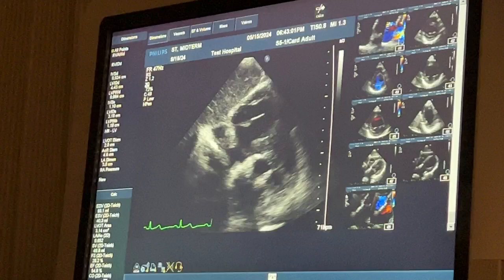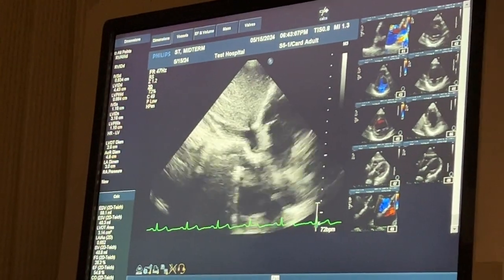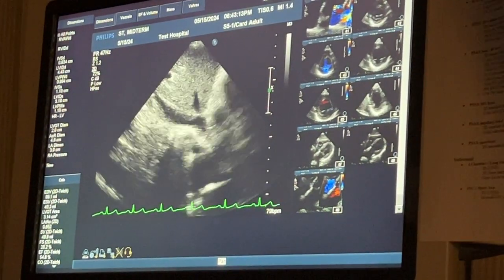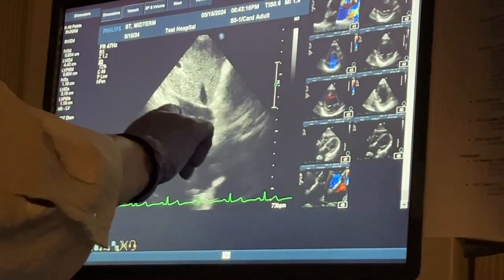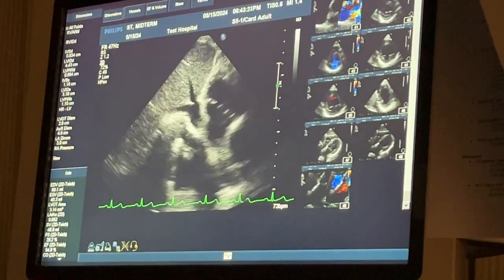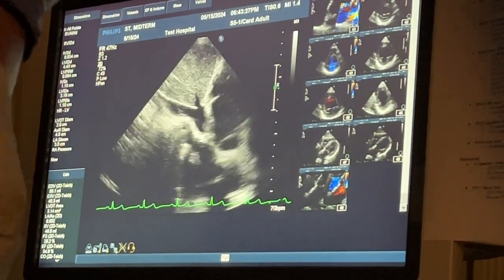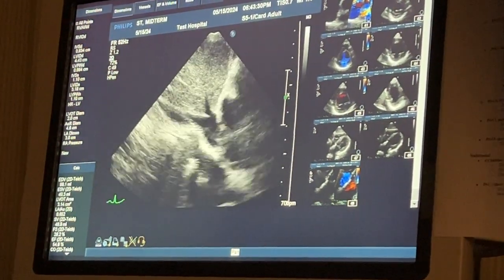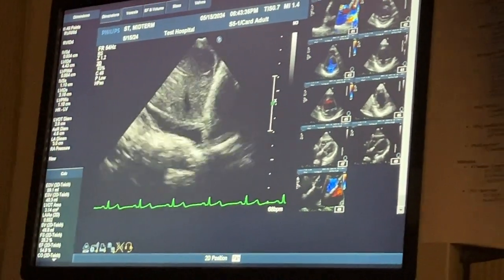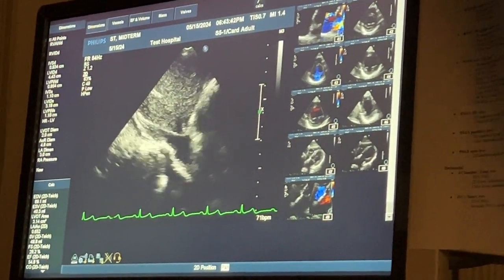Now I twist my indicator and look at the IVC. What I like to look for is this vessel being all the way across the screen. That takes a twist of the indicator, because right here I can start to see the IVC, but it doesn't open all the way up. I'm twisting it left, right, until you really open it up. There's not one size fits all for this. I also like to see this hepatic vein. It's looking good. We can already see good respiratory response.